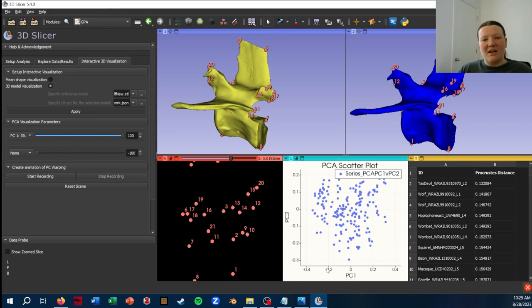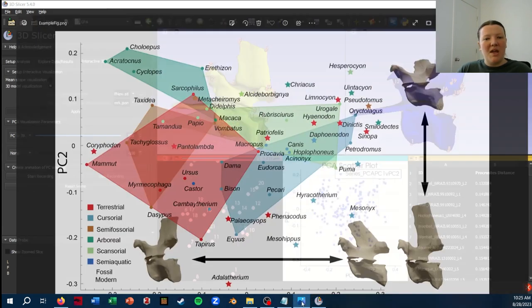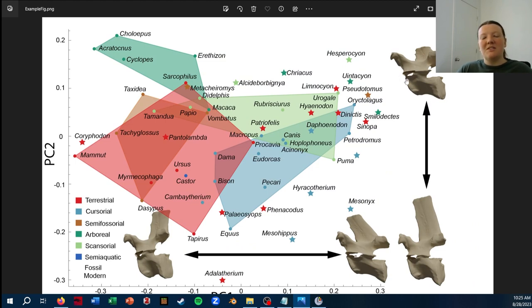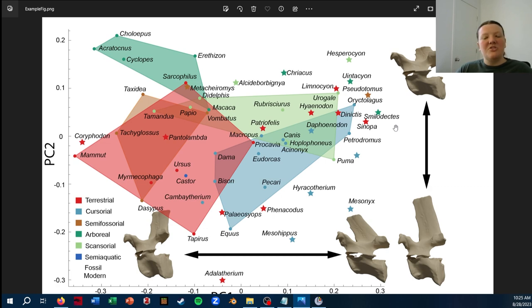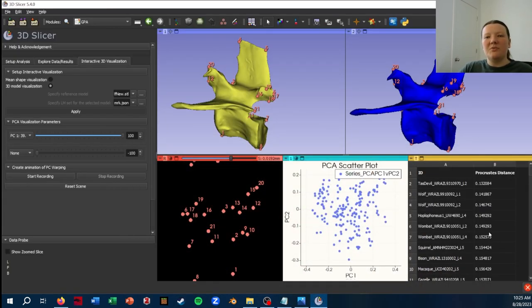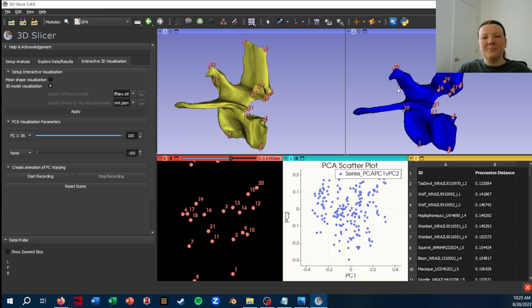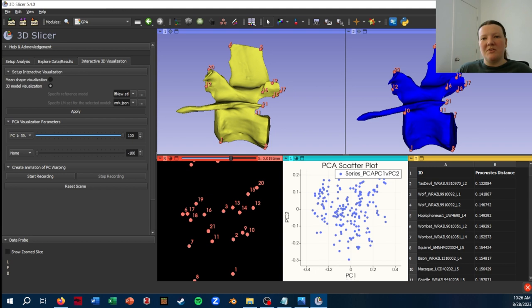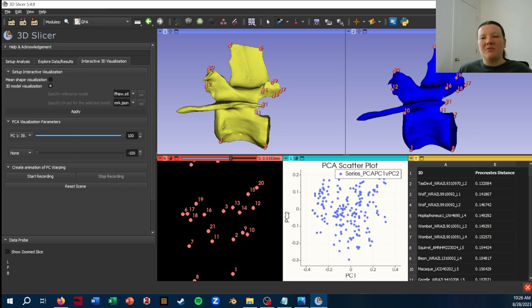And in fact, when I made this figure, I actually clipped off the transverse process just so it would be extra clear what the shape changes were that I could actually start to make some interpretations from. Okay. With all that said, let's say I want to export these models out of Slicer. Slicer does a lot of really cool things, but rendering, I have never found it to be really great at, especially if you're going for paper quality figures.